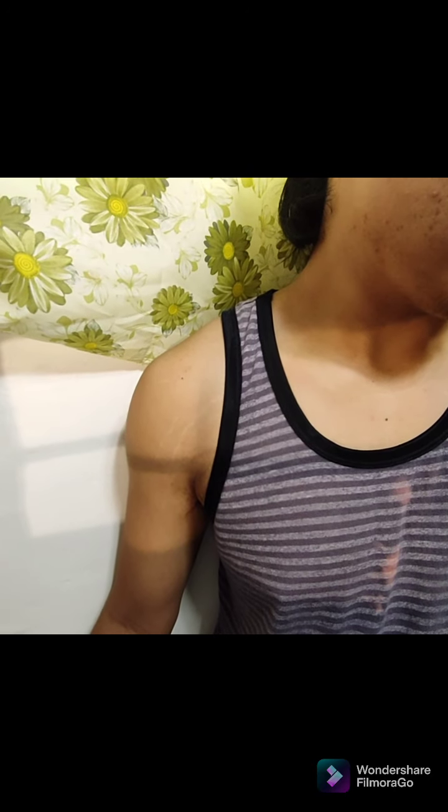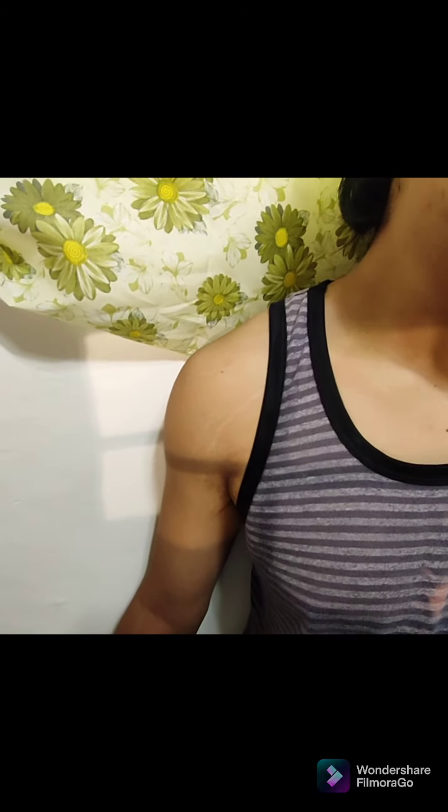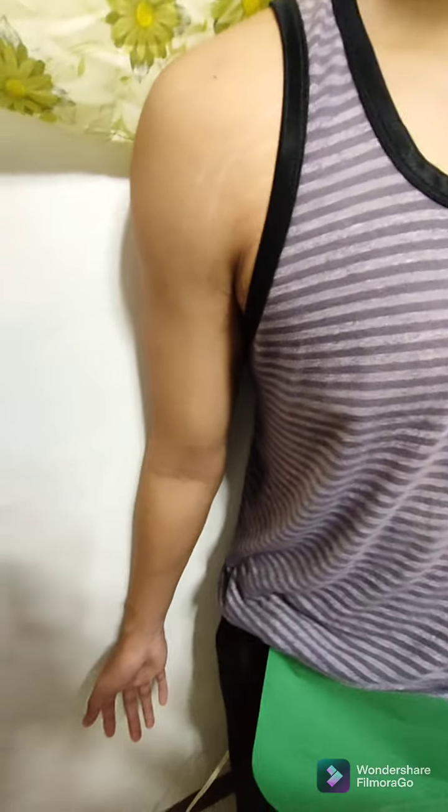Then, before proceeding with shooting the beam, make sure that you instruct the patient to suspend respiration during exposure. So sir, sunod lang sa instruction sir. Inhale. Then, shoot the beam. Then you can now ask the patient to exhale. Exhale na po sir.